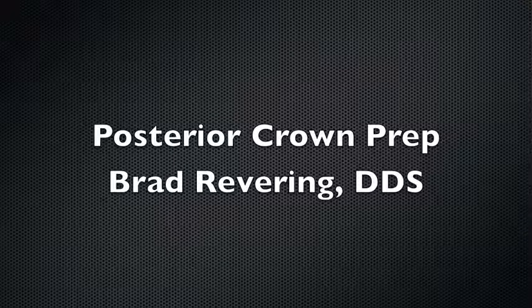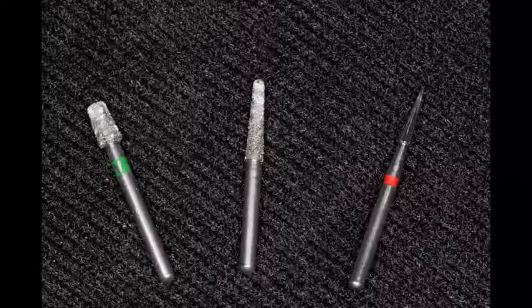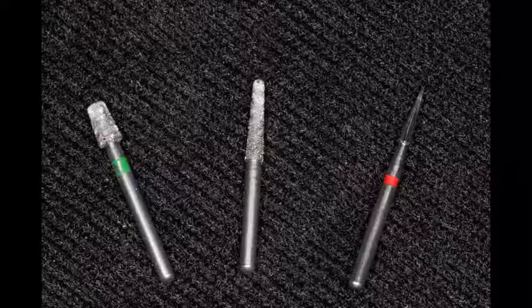This presentation is on how I prep single unit posterior crowns in my office. There are really just three burrs that I use for this process: a fat diamond burr, a regular shaped diamond burr, and then I finish it off with a carbide finishing burr.